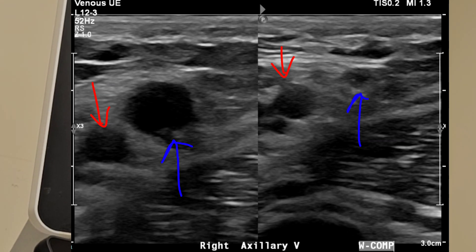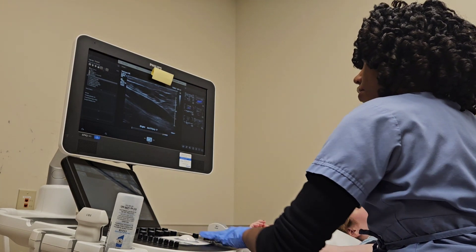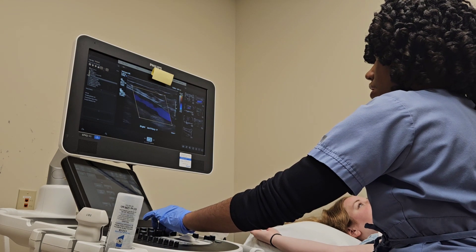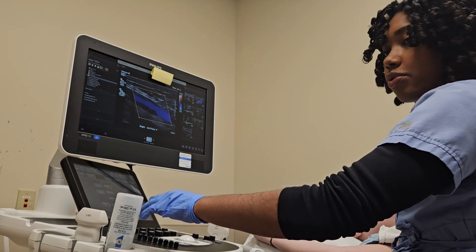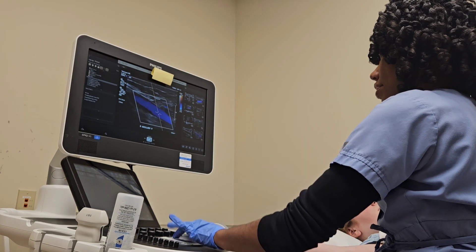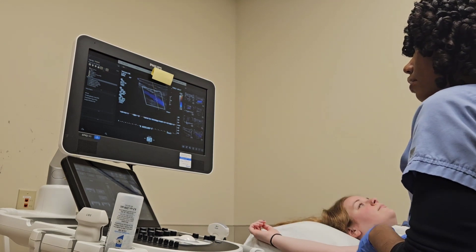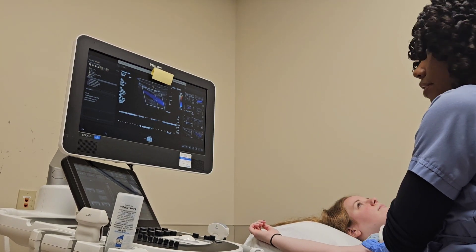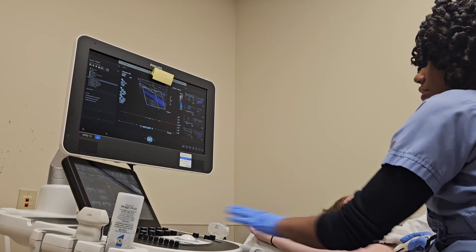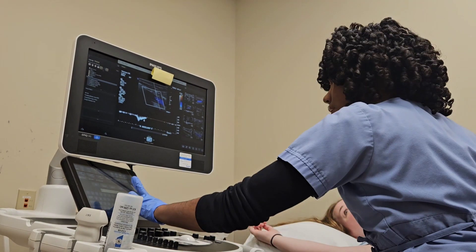I'm going to turn from transverse to longitudinal and get that vein stretched out well. Then turn on color and steer — if you don't know how to steer, I did create a course for that, and you really do need to know how to do that. Take a 2D image first, then get our pulse wave. Now I'm going to squeeze on the inside of Skye's arm — that's a little bit of an augment. That's as good as it's going to get; I'm not going to hurt my patient. Augment done.